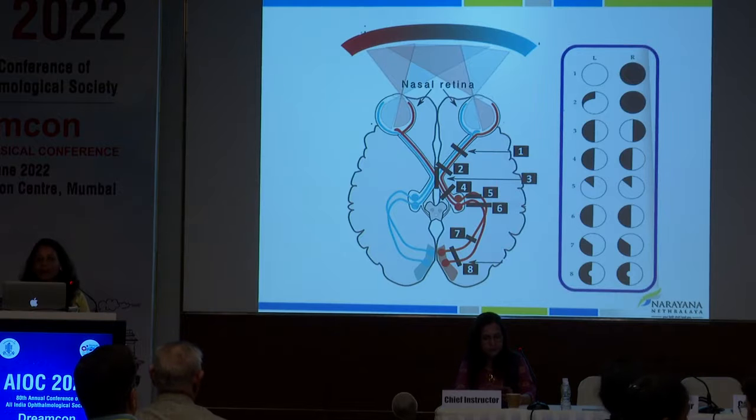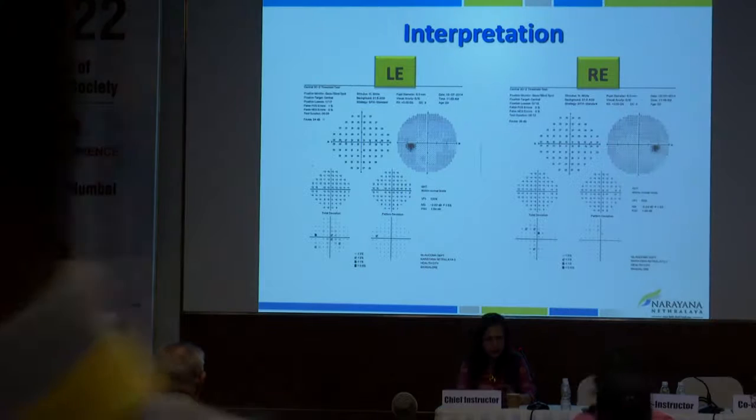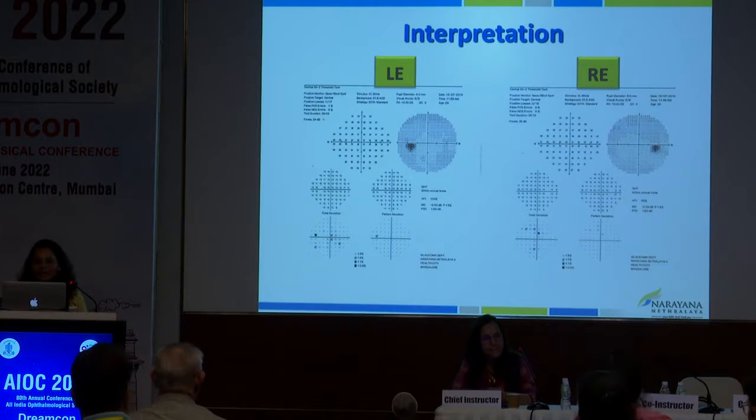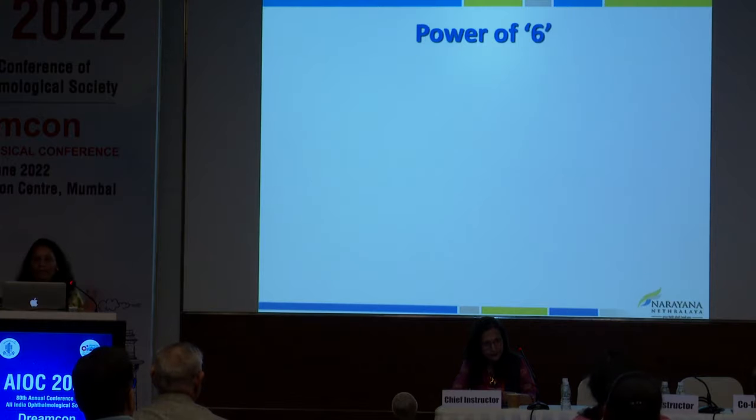evaluate that. Now, unlike what we've done in glaucoma, when you are evaluating neurological fields, always have both the fields in front of you. Especially for students, if they give you one field, ask for the other one, because you need to study them bilaterally. So right eye on your right side, left eye on your left. Note the blind spot. It should be temporal in both cases. You have to look at the gray scale. Unlike glaucoma, where you look at the pattern deviation, here you look at the gray scale. And you ask these powerful questions.